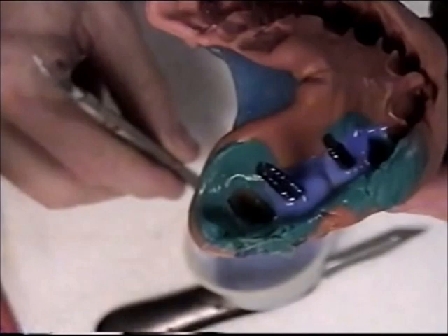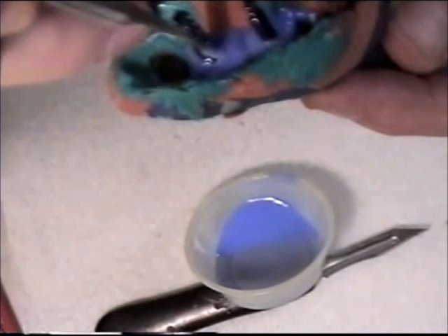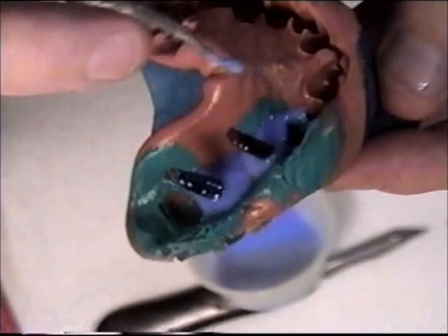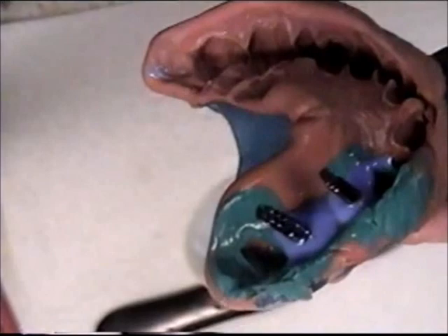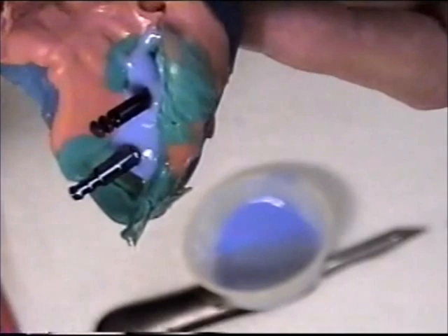Now it's quite messy right now. As you can see, it's flowed even into the other teeth. But I'm going to be cutting this away, so I'm not really concerned about that. So I think I'm looking at about half a millimeter beyond where the analog starts, which is the base of the implant. My material's starting to really set up fast now, and I'm in pretty good shape. So there we go. We're going to let this set up.